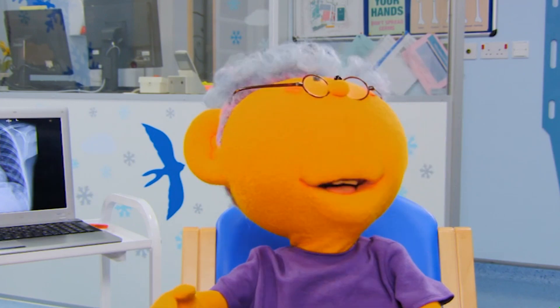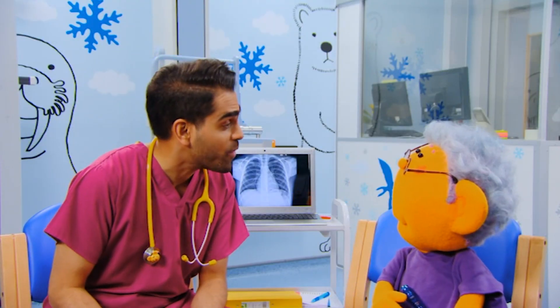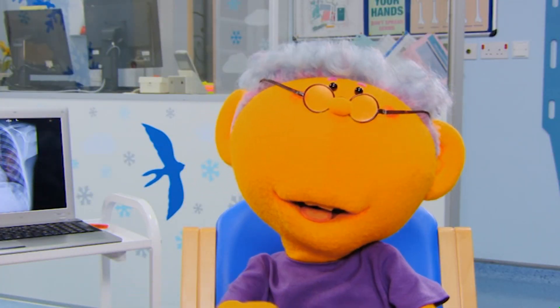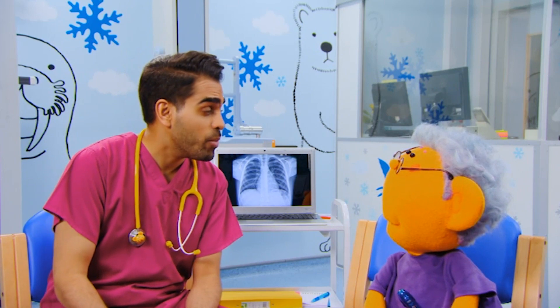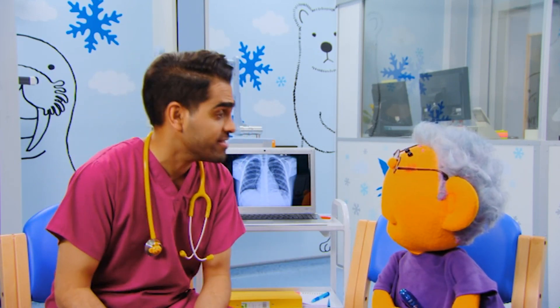Oh, this looks interesting. This is the X-ray room, Riz. You're going to have an X-ray today. I know. It's on our calendar at home — X-ray day. But Puddles doesn't know what it is. Well, we're going to use an X-ray to look inside your chest at your lungs. Wow.